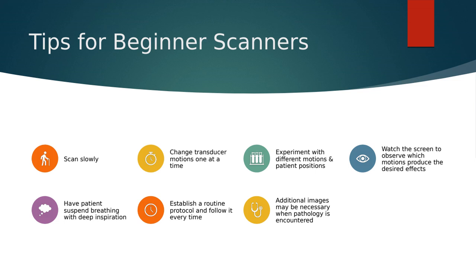Now, I say when you're first starting out because I don't want to hear a year from now, when you guys have been in clinic for 9 months, that you're taking 42 pictures of one organ. So we're going to find that sweet spot. But when you're first starting out, and especially in lab, more is better.